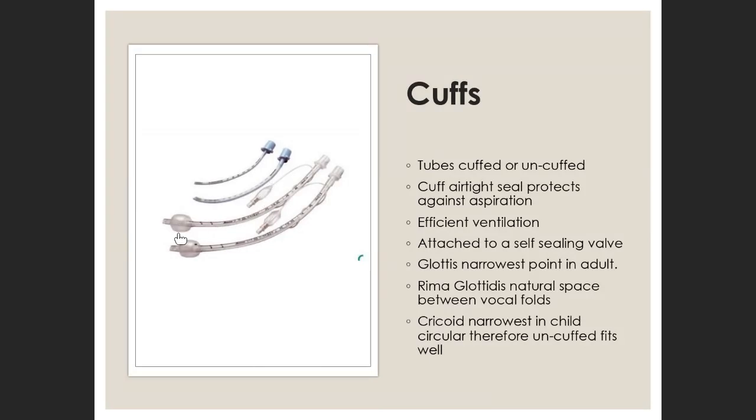What it does is that it allows a proper seal in the trachea, just below the larynx, and therefore allows us to be able to ventilate.